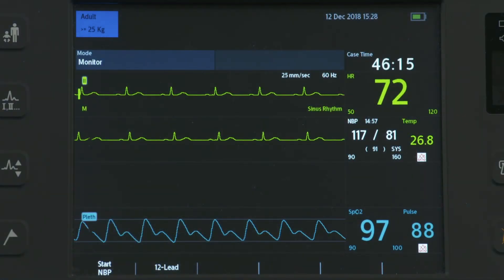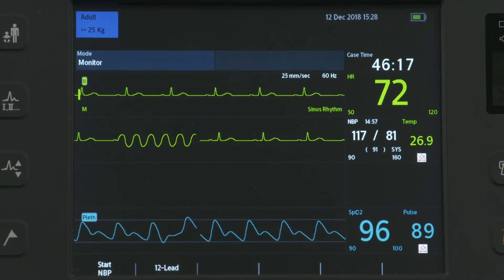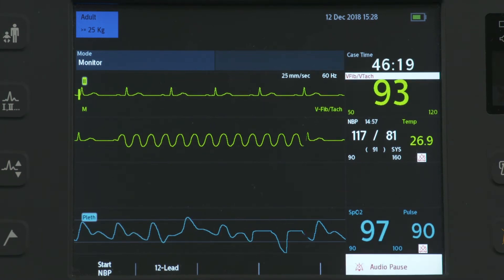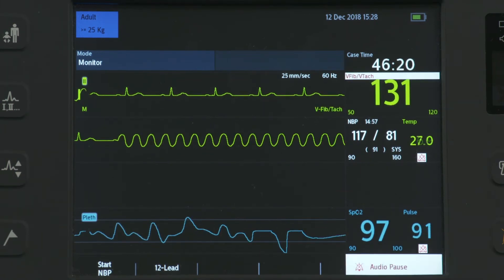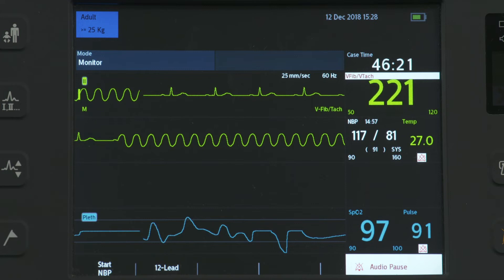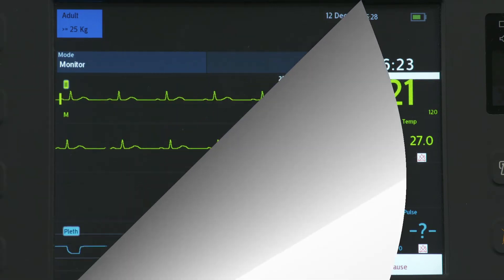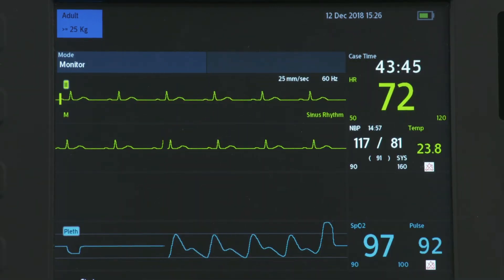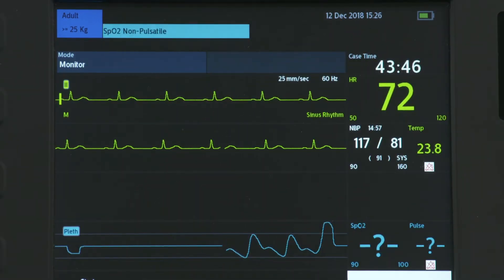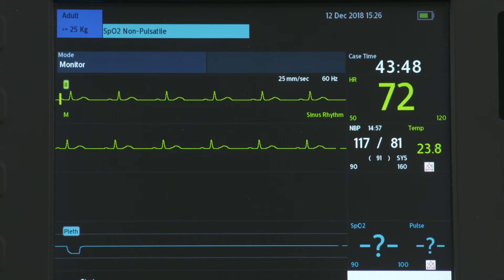The HeartStart Intrepid has two alarm categories: one indicating changes in the patient's condition, called physiological alarms, and the other for device and cable issues, called technical alarms, which may require attention.